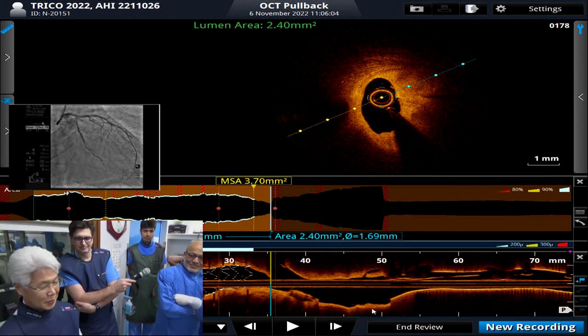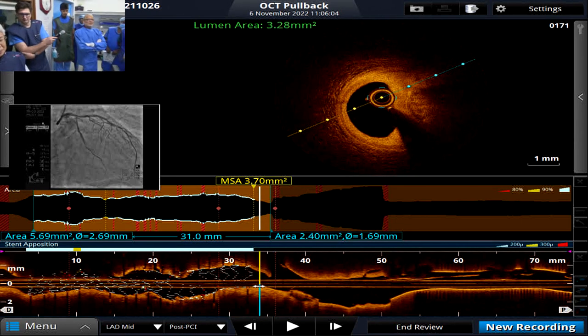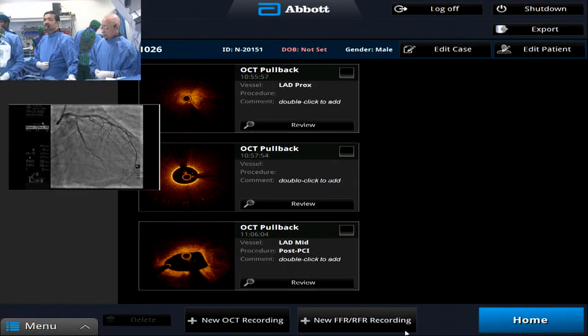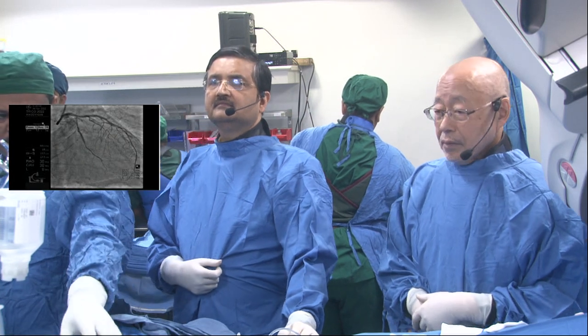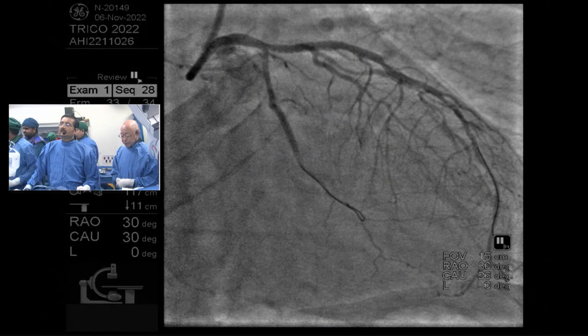I realize I'm the one that brought up the physiology, right? And I think in this situation, that's probably what I would do. But truthfully, if I decided on a procedure plan for this, having imaged it early and up front, which is, I think, where Dr. Katie was going earlier on in the discussion, having seen lipidic plaque with some calcification that was not expansion limiting at the proximal LAD, I probably would have planned the case as a crossover and gone left main right down from normal to normal, because we know that that's sort of the optimized result approach, right?